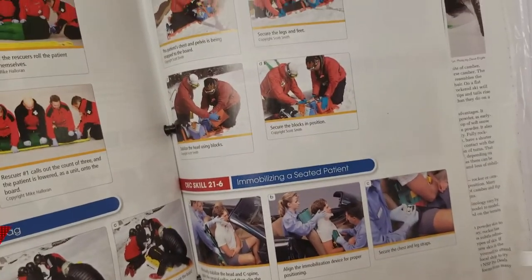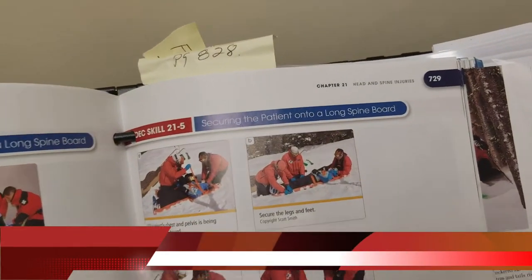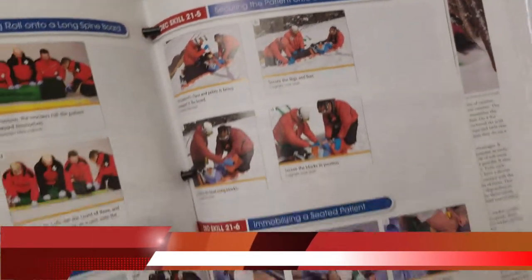So, Short Board of Mobilization is in the OEC Manual, 5th edition, on page 729 and 730.